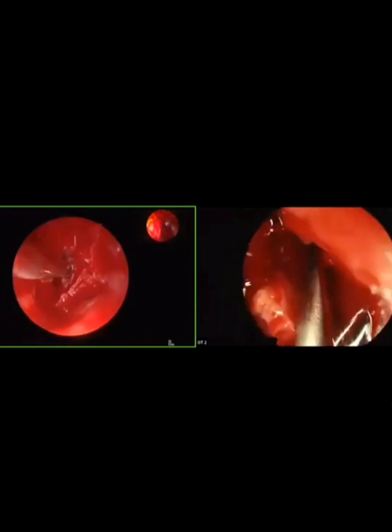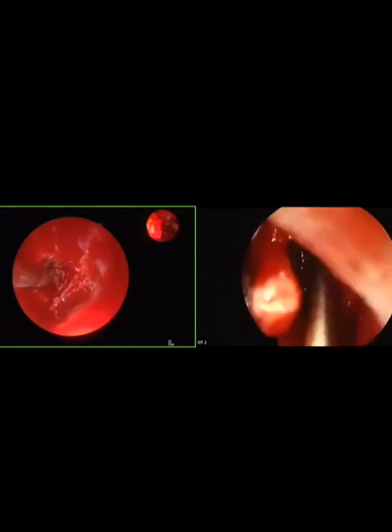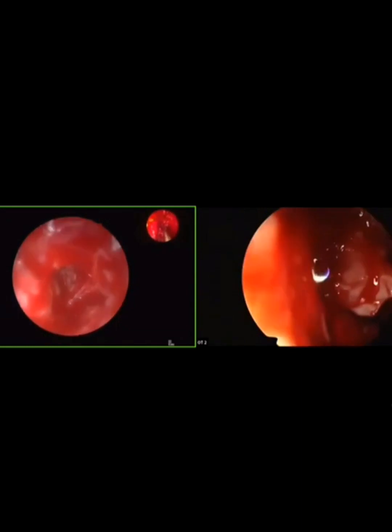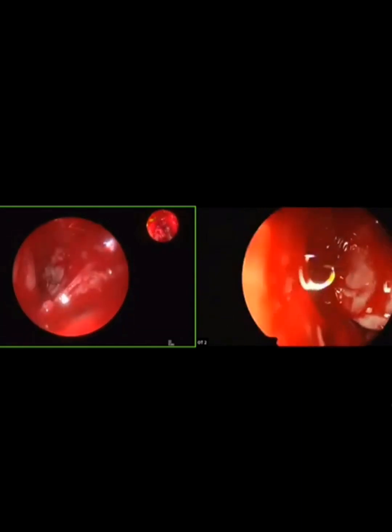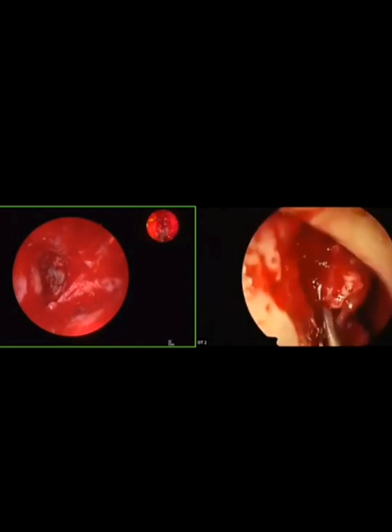See, I think a type 4 cell was there. In the CT scan, I had already broken this cell with the debrider. This was the type 4 cell. But now it's very difficult to remove that bone.